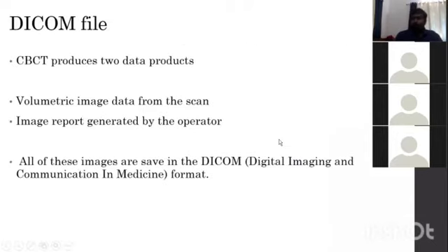And coming to the DICOM file format, this is a standardized file format that is used to share or transfer medical images or files from one place to another. The abbreviation stands for Digital Imaging and Communications in Medicine. We transfer these 3D or CBCT images on a CD in DICOM format, and we just add a viewer to view the file.